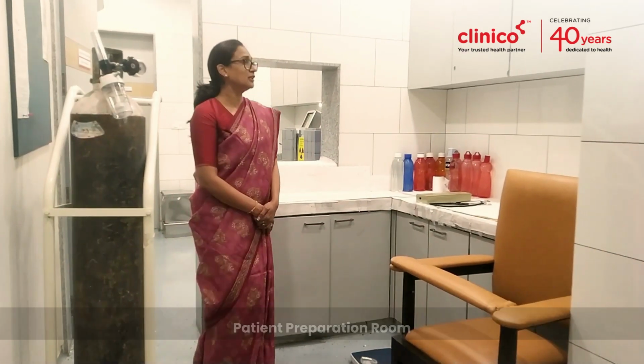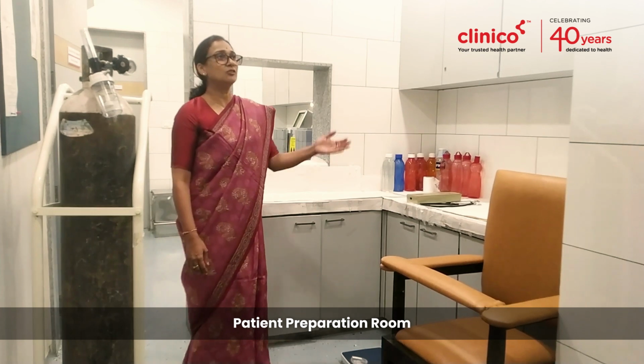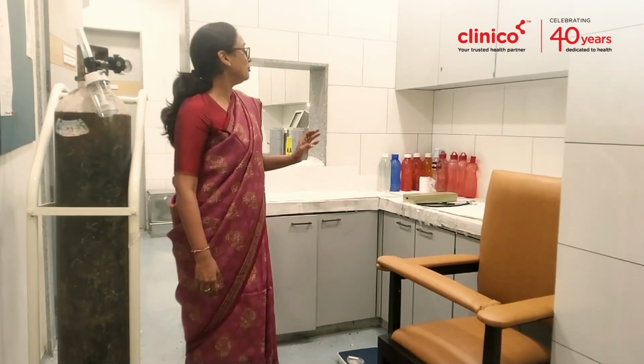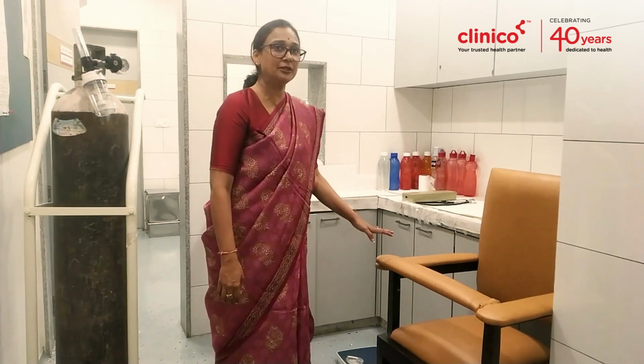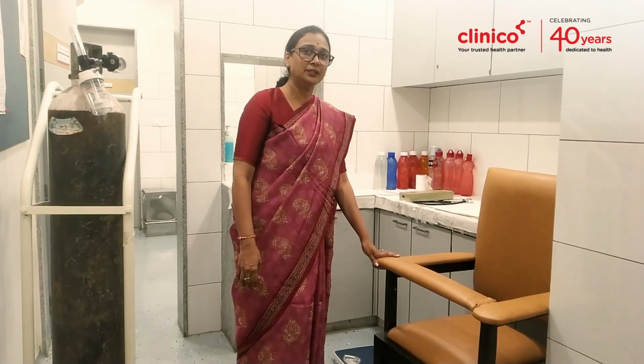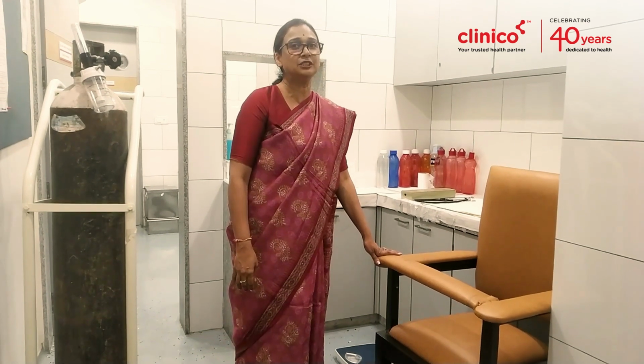Here we take the patient's weight, following which we take height, measure pulse, blood pressure, saturation. Then we make patients sit comfortably on this chair, put the venflon and inject the patient with the FDG.